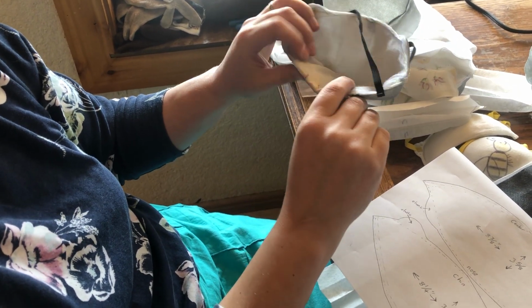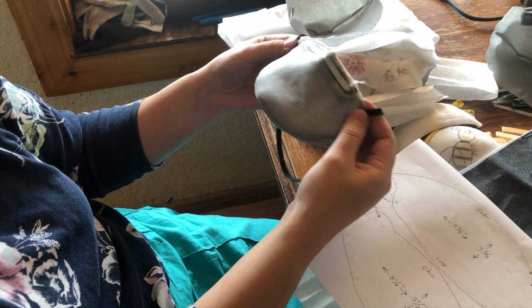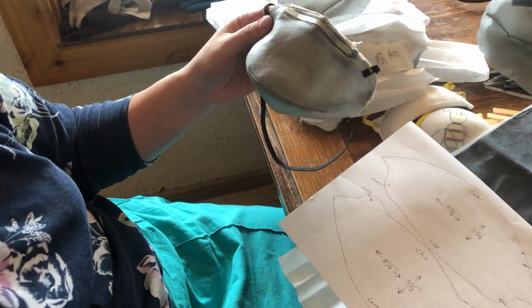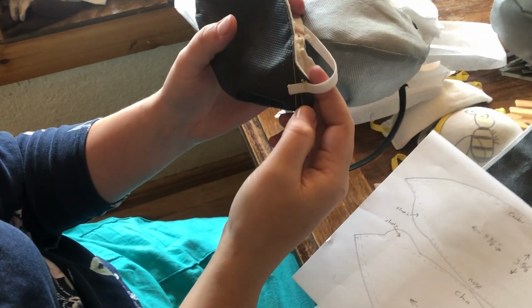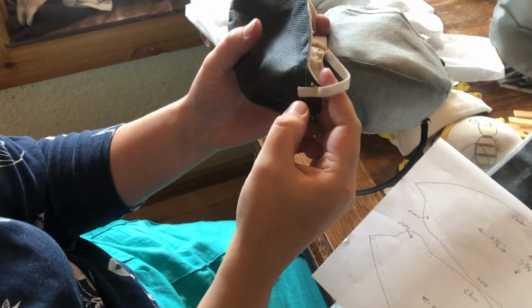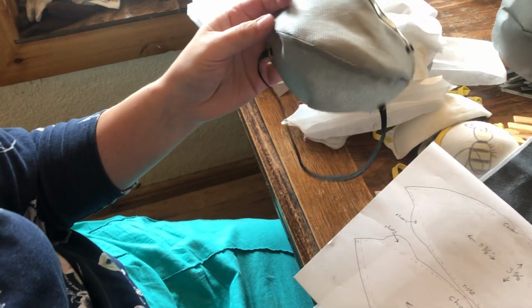It's nice and padded on the top. I got this stuff all tucked in. I'm trimmed up. I stick my elastic on. The first mask I made, this one, I was careless with my elastic and I just put it on there thinking it was fine. Well, it was a little bit tight. I recommend 11 inches, but I recommend moving them all the way to the edge.